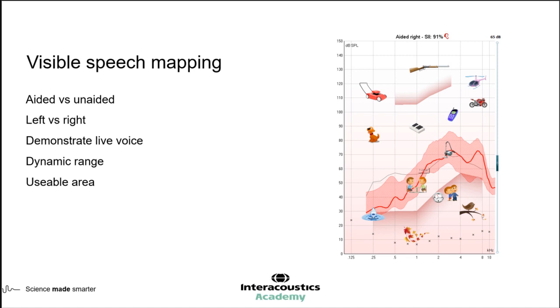So I find that an audiogram, to a lot of lay people, or people who are not familiar with audiology, they find the upside down nature of the audiogram a little confusing. I think when we flip it this way round, it helps to make a lot more sense to people.